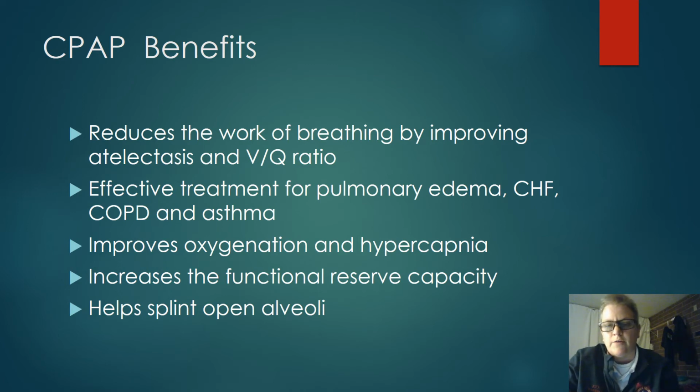We know it's to help us treat pulmonary edema, CHF, COPD, and asthma. So improves oxygenation and hypercapnia, increases the functional reserve capacity, which is a great thing, helps splint open those alveoli. So that CPAP with pressure support is like BiPAP. So it provides an inspiratory and an expiratory pressure.